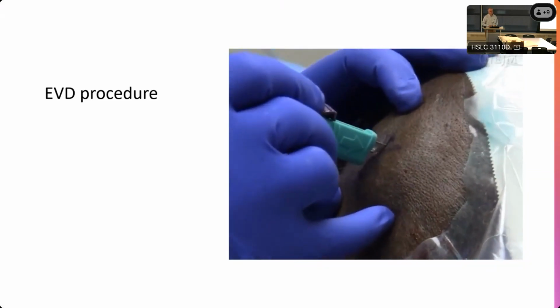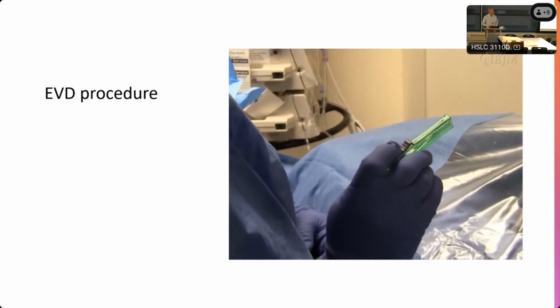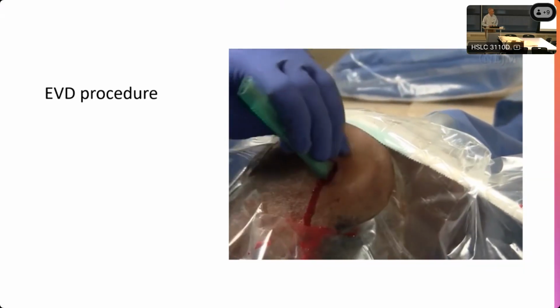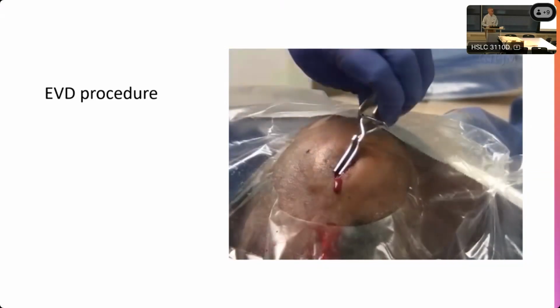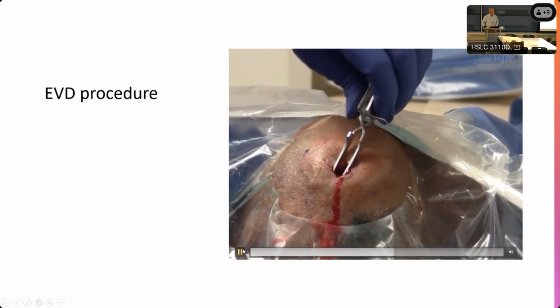Using the scalpel with the number 15 blade, make an incision down to the bone. Secure the scalpel blade and scrape the pericranium using the handle of the scalpel. Use the retractor to hold the edges of skin open. Position the twist drill at the center.